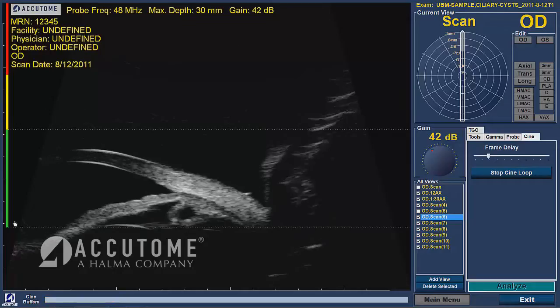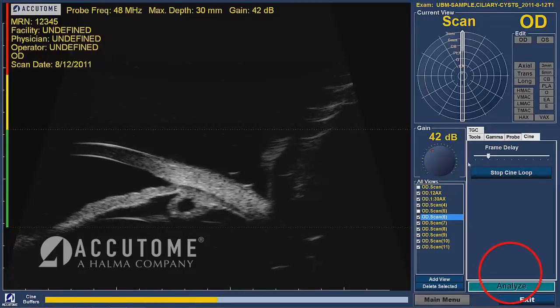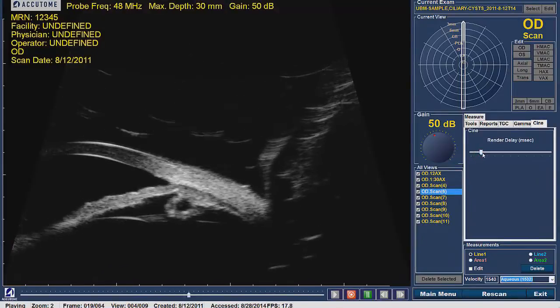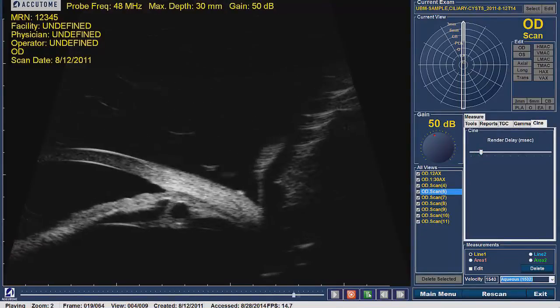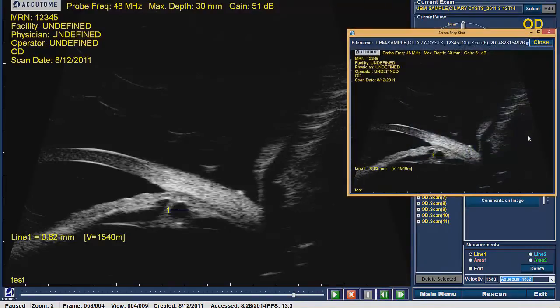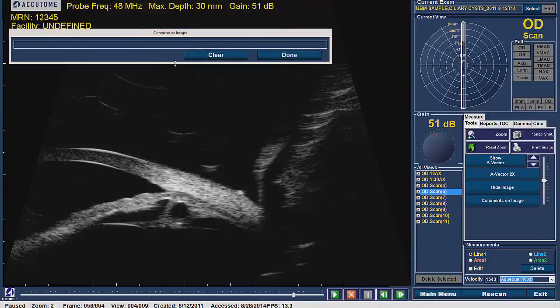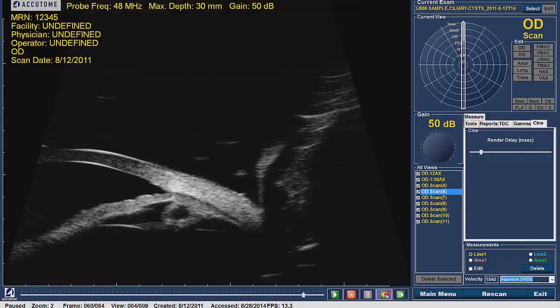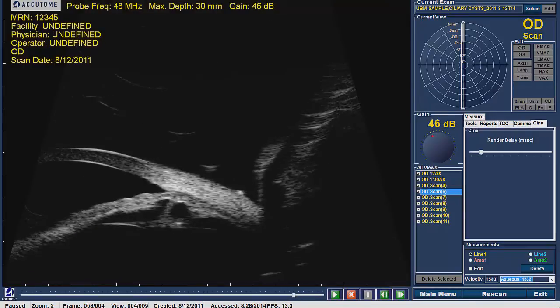Once scanning of the eye is complete, drain the fluid from the eye and remove the shell. Then click on the Analyze button located in the bottom right-hand corner of the screen. The software will change into the Analyze screen where scans can be reviewed and replayed. In this mode, the user has the ability to take photos of the scans, comment on the images, apply measuring calipers, adjust the gain settings, and export images to EMR or a Word document report.